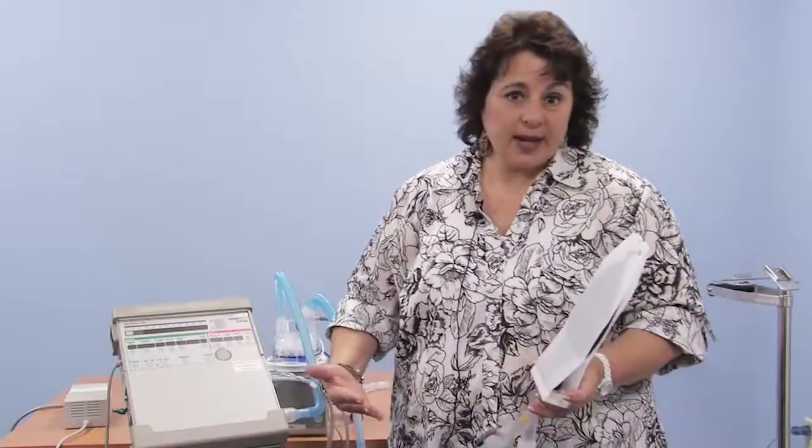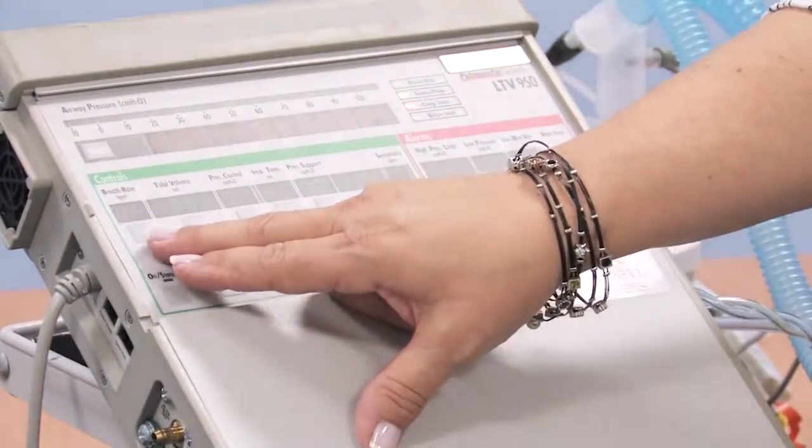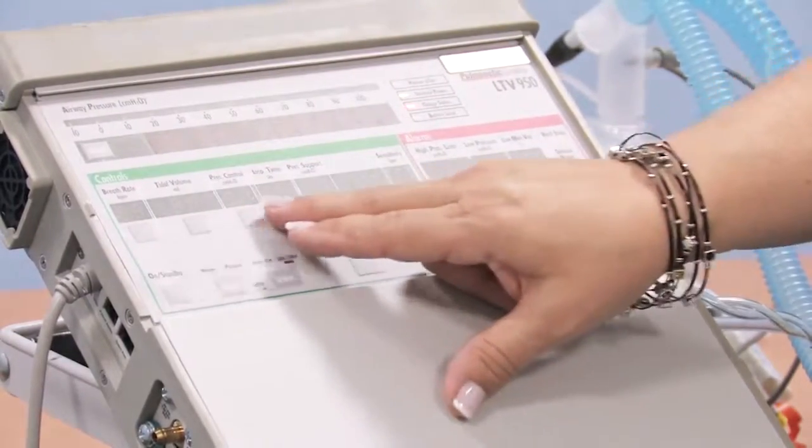It not only looks like a computer, it is a computer. So there are a lot of internal settings to adjust for comfort of your child on the ventilator. And those will be explained to you as they're determined. They will be something that will be noted in the DME equipment file so that if you need a change out of your ventilator, they can preset the machine that comes to your house in the event that it's time to change it out to a new one, or if you had an issue with the ventilator, they would know your child's prescription. So we have how many breaths a minute, what type of breath that's going to be.